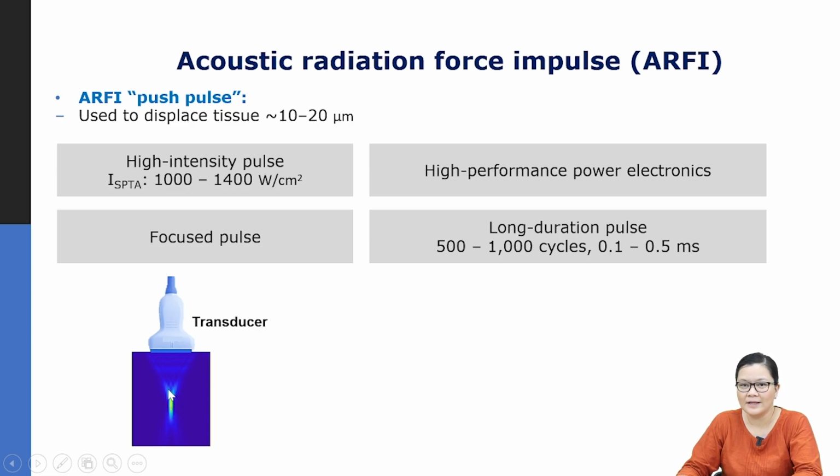So you can see that at the focus there is really high intensity of the wave here. And what's needed to be able to produce this focused beam is high performance power electronics. So you really need electronics that will enable you to generate these radiation force impulses.